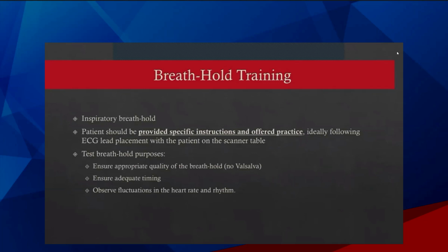So also, you want to ensure that the quality of the breath hold is good. You don't want them to do a Valsalva movement where they're bearing down, because actually you can wash out some of the arteries when you do that. So we really don't want Valsalva, just a good, solid breath hold.